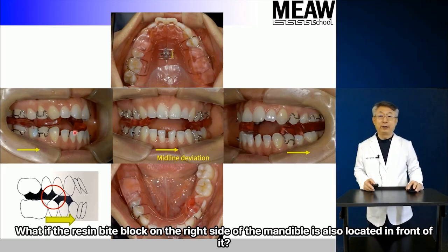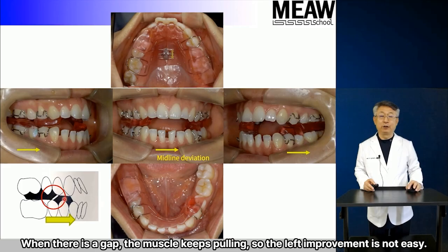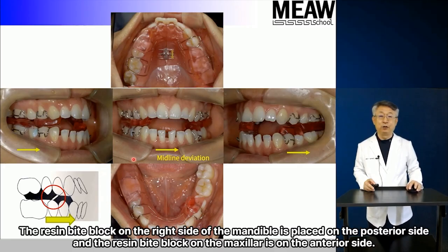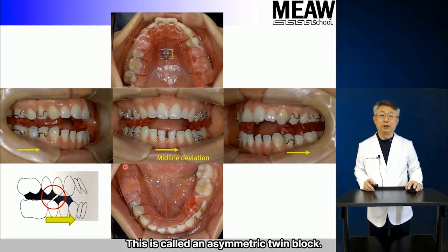What if the resin bite block on the right side of the mandible is also located in front of it? There is a gap between the upper and lower right resin bite blocks. When there is a gap, the muscle keeps pulling, so the left improvement is not easy. How do you compensate for this? The resin bite block on the right side of the mandible is placed on the posterior side, and the resin bite block on the maxilla is on the anterior side. This will prevent the mandible from moving to the left, as there will be no gap here. This is called an asymmetric twin block.